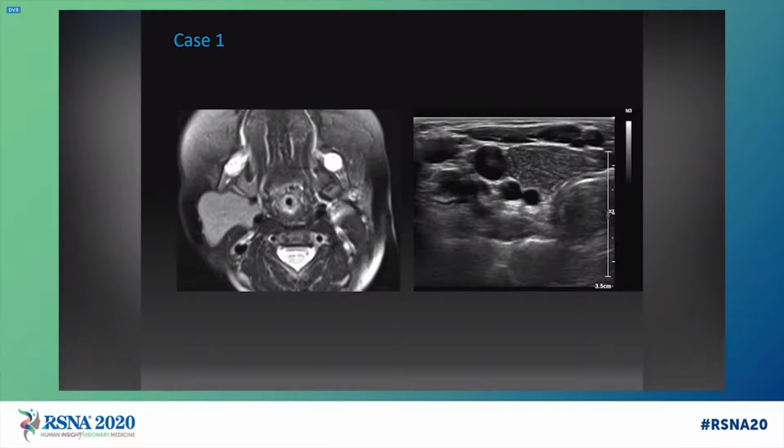This patient went on to get an ultrasound, and you can see here this very classic appearance, kind of like a starry sky with these little speckled areas that are echogenic. So this is a case of an ectopic thymus. And the identifying points are that number 1, it's pliable, so it tends to be triangular and conforms to the shape of structures around it. On ultrasound, a starry sky appearance. And then also the location has to be correct, because all embryologic lesions have to conform to embryologic geography.